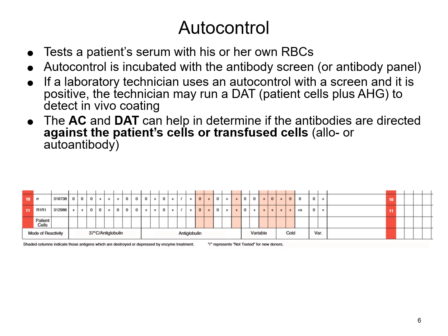They will only do an autocontrol if they need to investigate an AB positive patient, just to confirm that they're not agglutinating themselves, or any other kind of investigation with ABO discrepancies and things like that. But your autocontrol will be run if you're working up a positive antibody screen. You can do an autocontrol with your antibody screen.